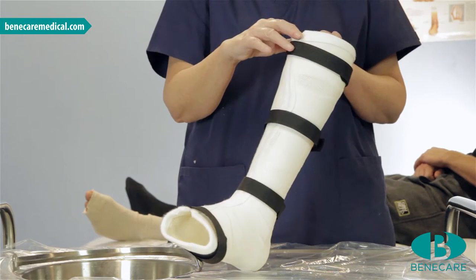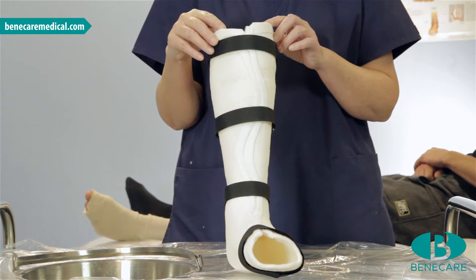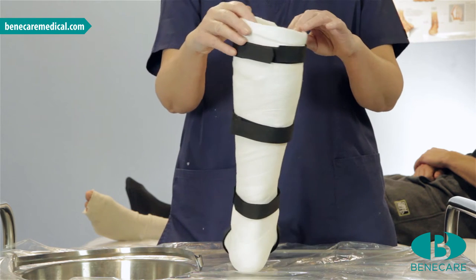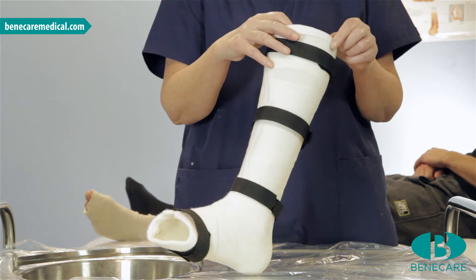The cast can be made removable at any stage of the treatment regime. The reasons for the need to have a removable cast include wound care, physiotherapy and personal hygiene.